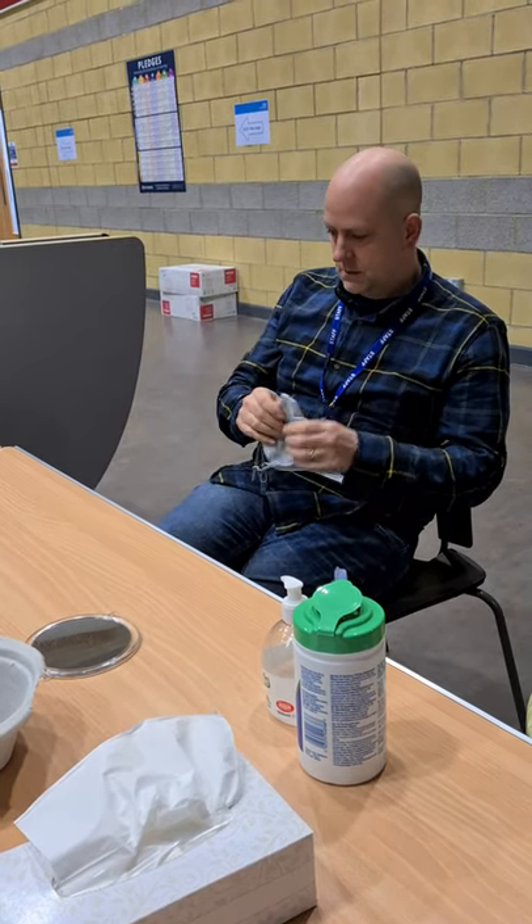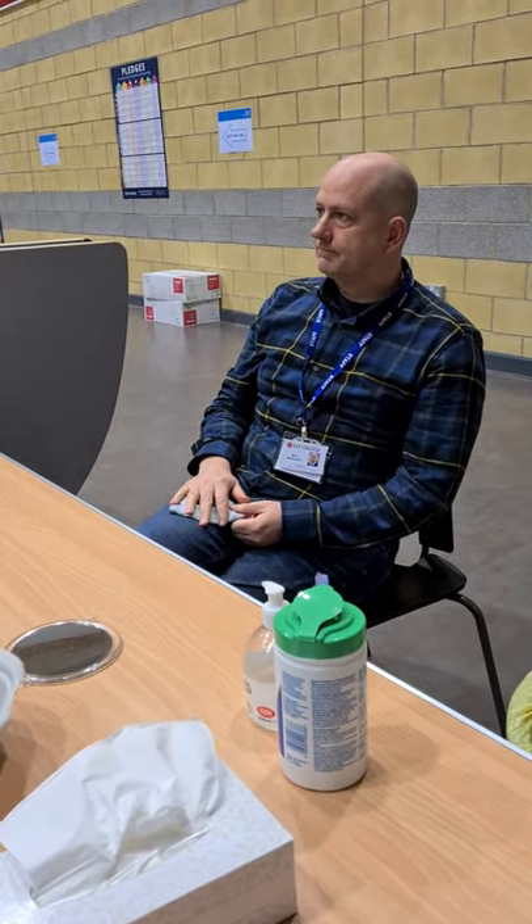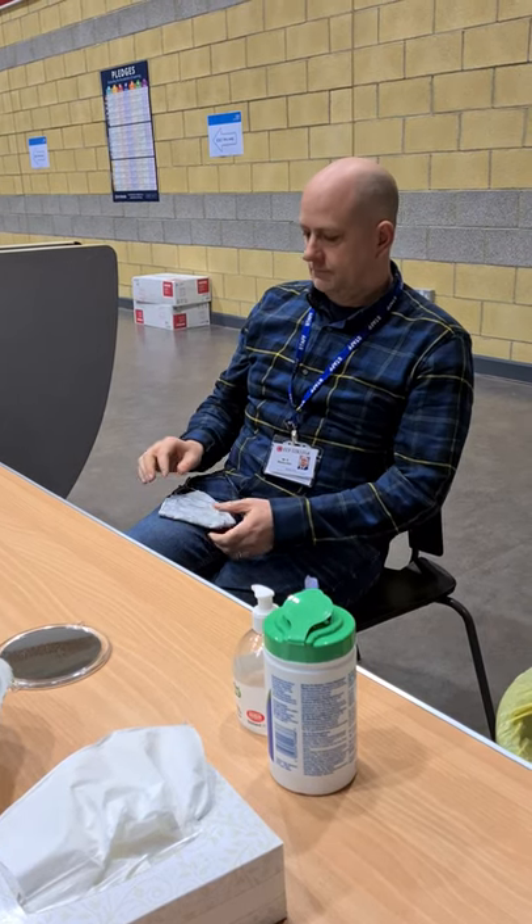If you'd like to take your mask off, sanitise your hands, blow your nose and then re-sanitise your hands please.